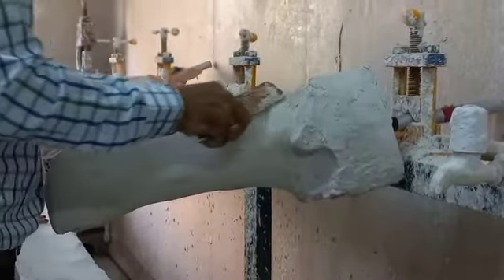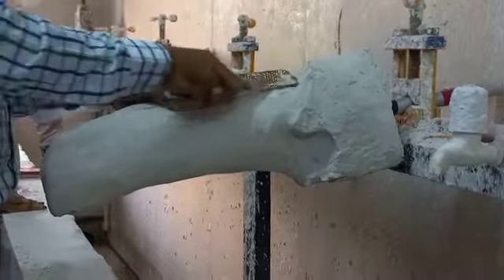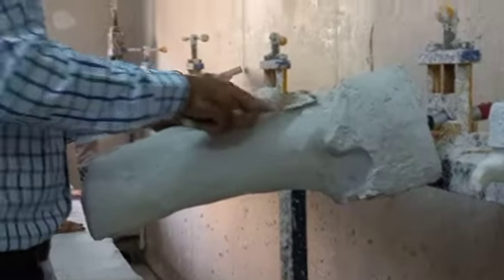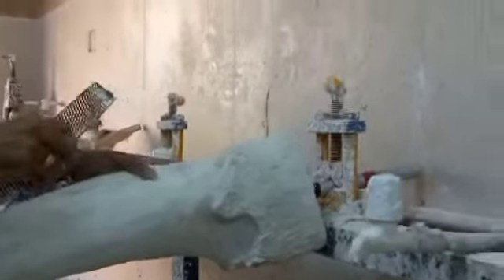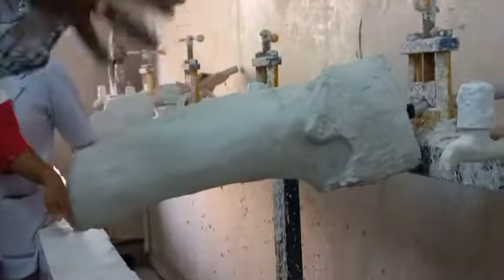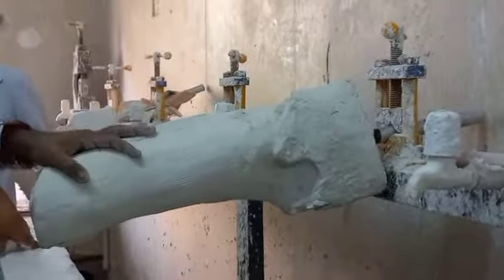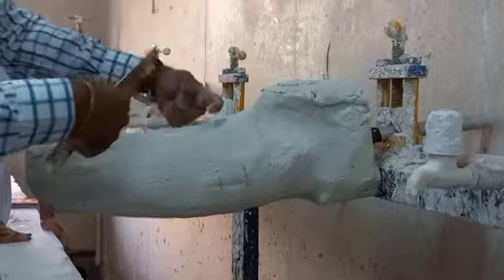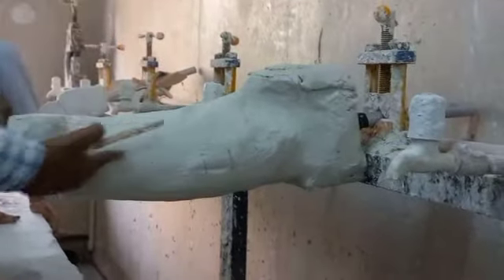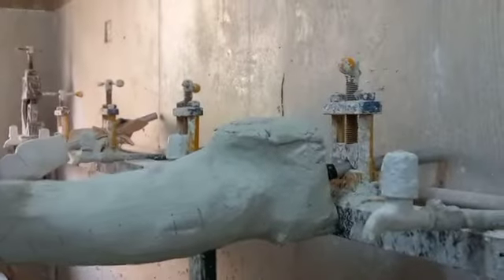So we have to really get his measurement in order to do the vacuum molding of this in order to check. After getting his measurement, only then can I be final and make it final. Maybe what I have done till now is too much reduced, so that even after opening this area, his leg cannot go. Let's say if I open it, it should go in a particular way. If I cut it open posteriorly like this, it should go. Only in the brim area, he must feel the load. That's what our goal is, right?